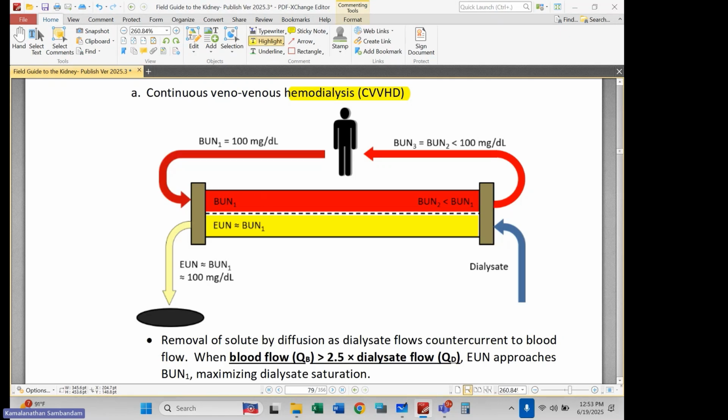So the dialyzer membrane's not limiting. Blood flow is the main limitation. In general, I'm running blood flow rates of around 400, dialysate flow rates of around 800, and then again, my urea clearance is somewhere around 270 or so. Not quite 300 is a typical urea clearance.